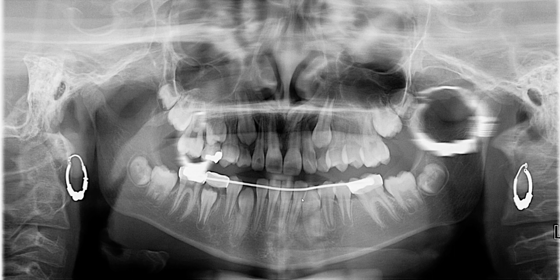That is absolutely correct. This patient is 10 years of age based on the eruption status. Chronologically, this patient also happens to be 10 years of age. Good job. I hope that was helpful, and we'll see you again.